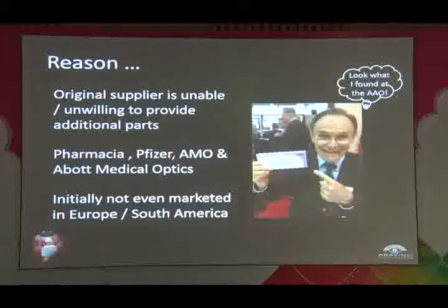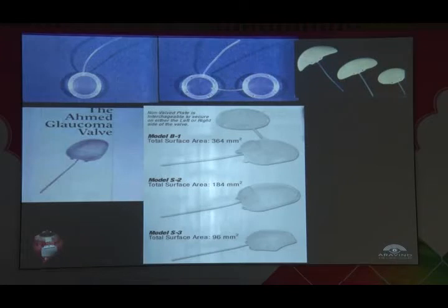And of course, another thing is the original supplier is unable or unwilling to provide this, and also the prototype of this Baerveldt was not marketed in Europe and South America initially, and now they have only patented it in the US as well as in Europe, and not in India and other African countries. We thought of the possibility of developing implants with so many other models like Molteno or Ahmed and Baerveldt, but since Baerveldt is commonly used by most glaucoma surgeons, we thought this would be the best product to manufacture in our RO lab setup.